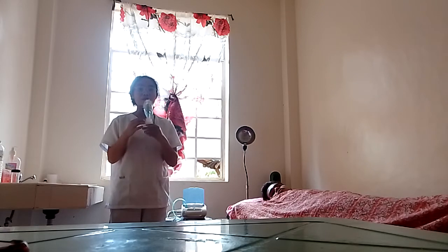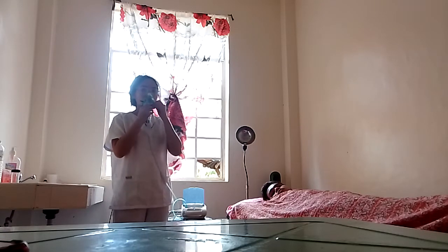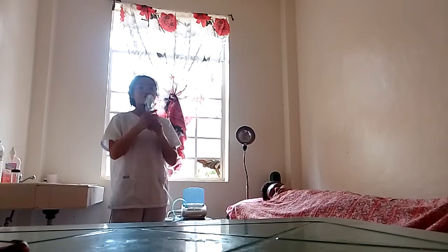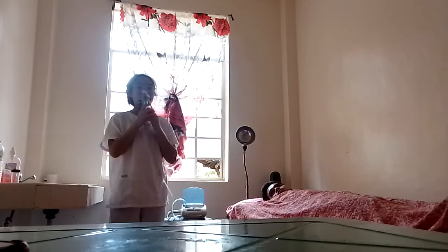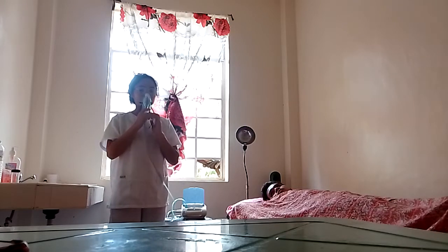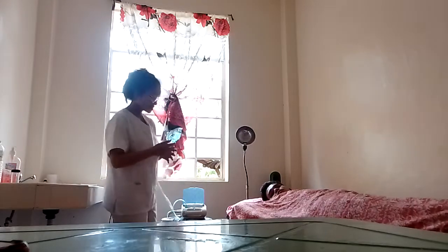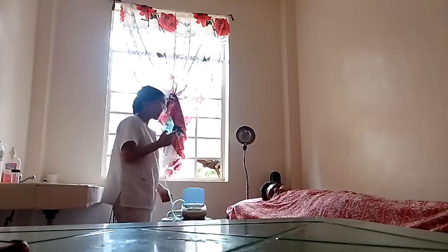Okay. And then the next step is we need to check for bubbling in the humidifier. So it helps us to determine there is air coming in and oxygen tank functioning. So i-check to nato na siya kasi yung ato mabutang dito is wala siya air nga nigawas. So i-check nato na siya before nato ibutang sa ato ang patient. Okay, we need to make sure that it is 1 to 5 L or minutes. Okay, so okay naman siya.